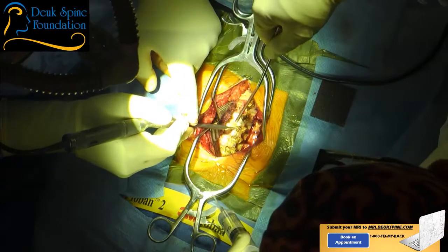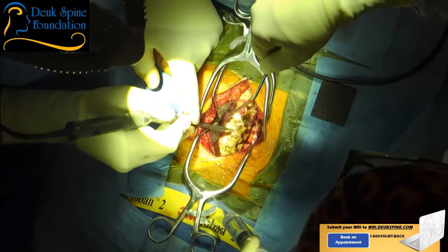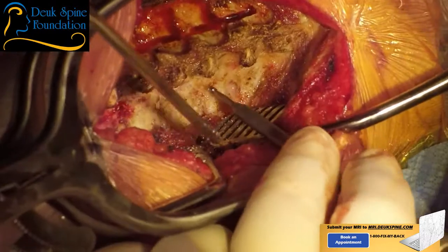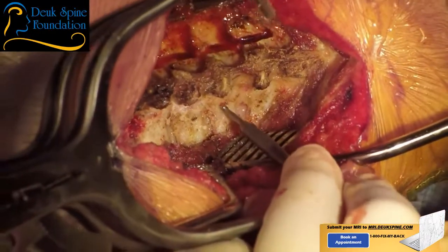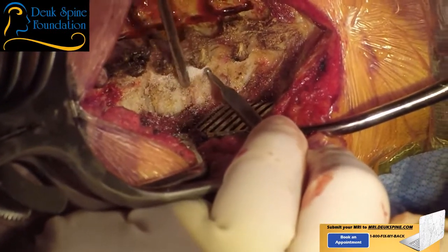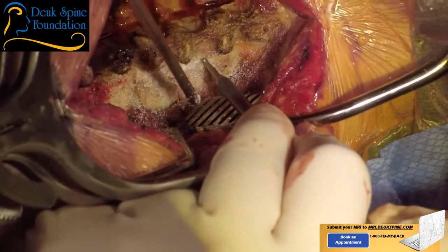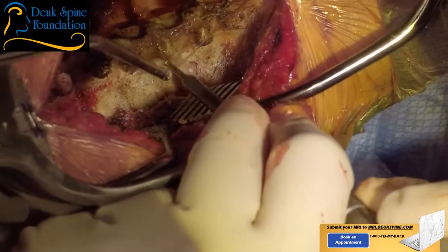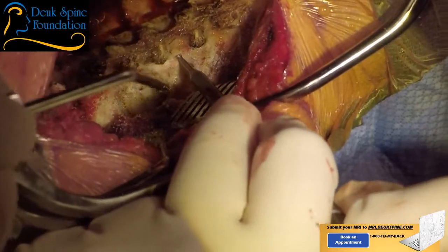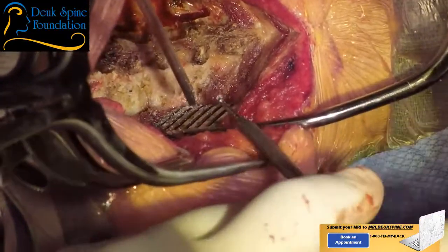Yeah, so for those of you who are newer surgeons, you've probably never seen tying off blood vessels with silk suture, but that's the way it used to be done. And for 100 years, that's all spine surgeons and neurosurgeons had: you just tie off the blood vessel. You grab a big chunk of tissue, wrap a loop of suture around it and tie it. And you can't cut through it, otherwise you're back to tying again. So there's been a lot of advancements to modernize these surgeries that make them much safer and more efficient for patients.